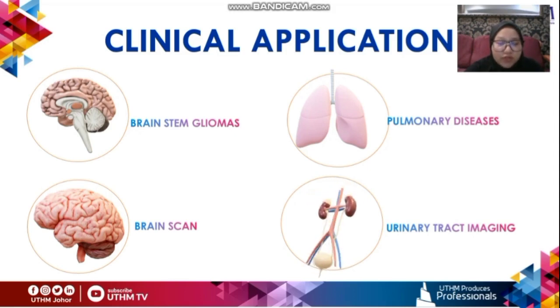Next, for urinary tract imaging, computed tomography is used to analyze the urinary tract with the injection of contrast into a vein. Before administering contrast, plain CT urography, which is the CTU, without contrast is used to assess stone disorder calcification inside the kidneys, density of renal masses, and presence of any bleeding. A CT scan is important currently to examine any strictures or masses inside the ureter or from outside but compressing on the ureter.